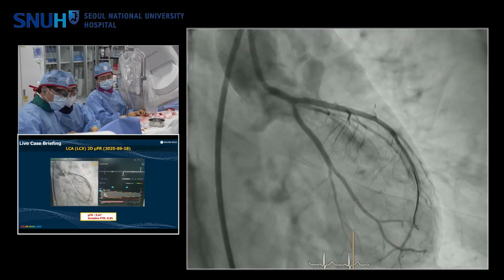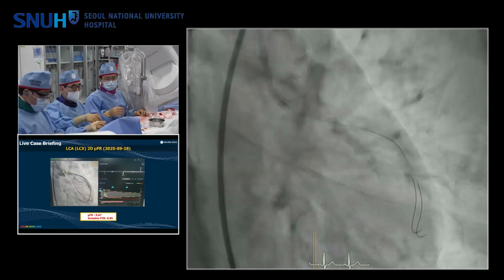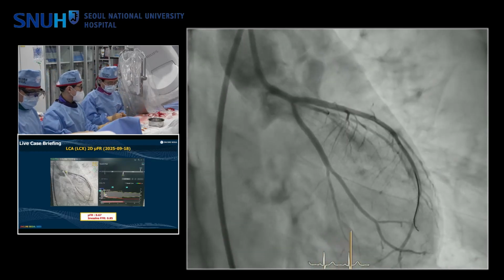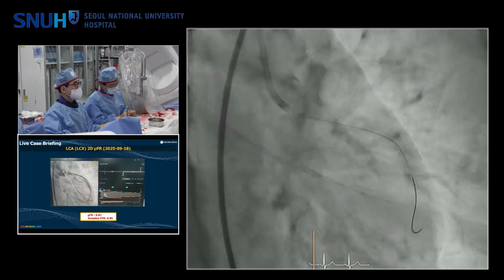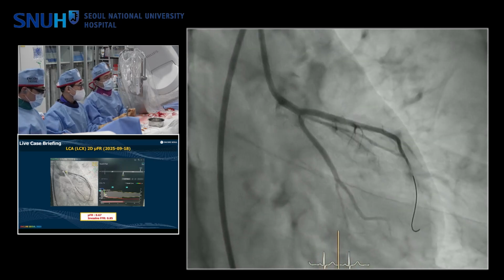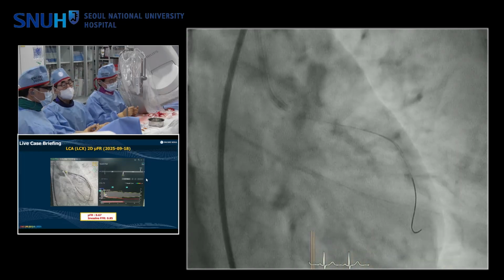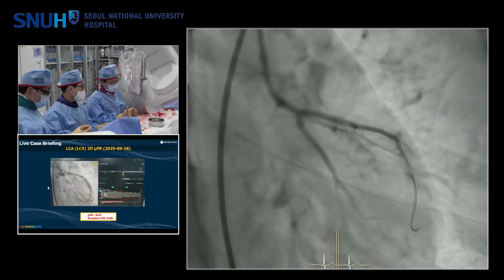됐어? 잘 잡아라. 꼭 잘 잡아야 돼. Can you do mu FFR again in this view? Okay. Yeah. 뮤에프랑 Could you do the mu FFR with this image? 니는 집중만 해. 내가 알아서 할 테니까. 요거 가지고 뮤에프를 측정해. 해서 두 개 3D랑 2D 다 해놓을까? 아니 마지막 이거 한 번 더.